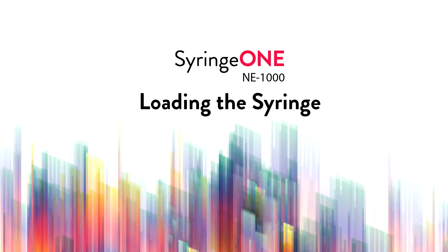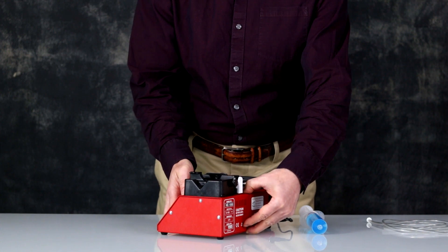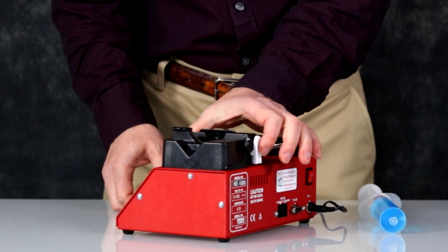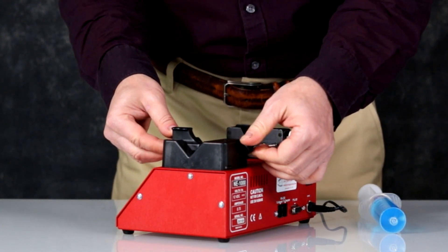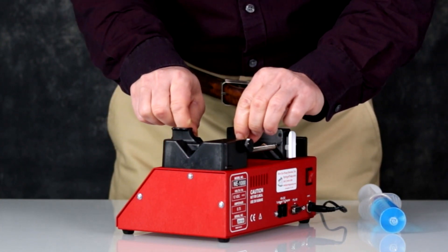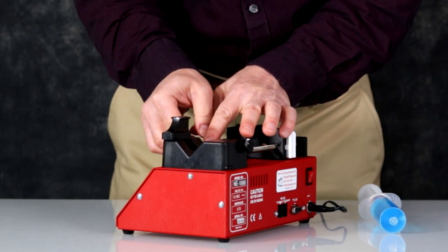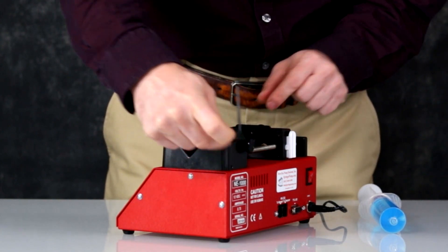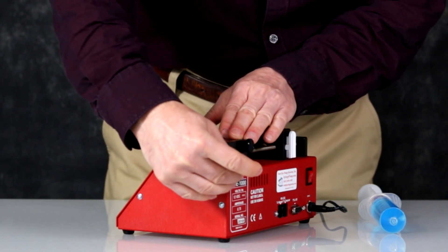NE1000 loading the syringe. Begin by pushing the pusher block back by pushing in the white nut block to release the pusher block. Loosen the flange by turning the two thumb screws. Lift the syringe clamp and turn it out of the way. If the collar clamp is tight, you can loosen it by taking the Allen wrench out of the tool holder. Loosen the screw and then return the Allen wrench to the tool holder.